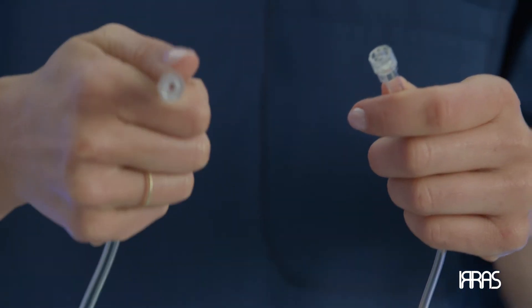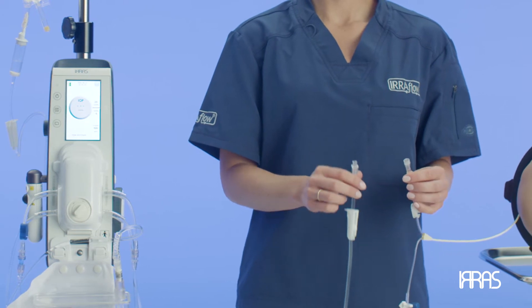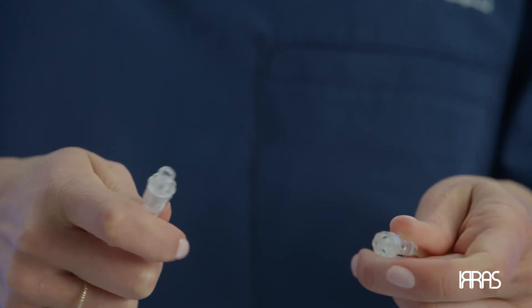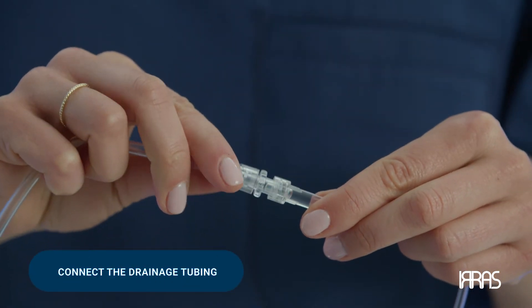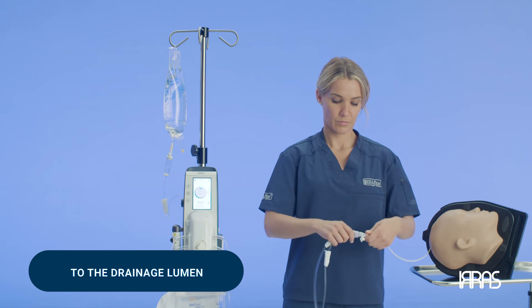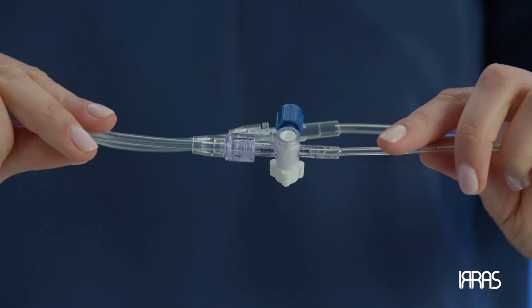You'll notice that the connection is a male-female connection on the irrigation side and a female-male connection on the drainage side. Next, connect the tubing that goes to the drainage collection system to the drainage lumen. The differences in connections ensures the appropriate tubing is connected to the correct catheter lumen.